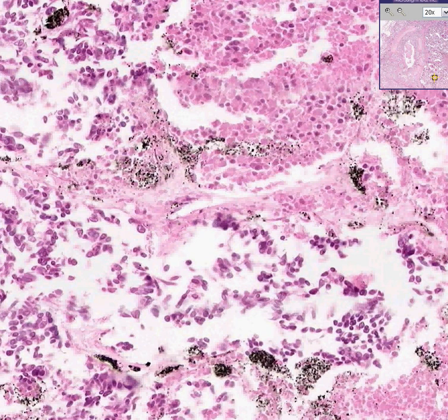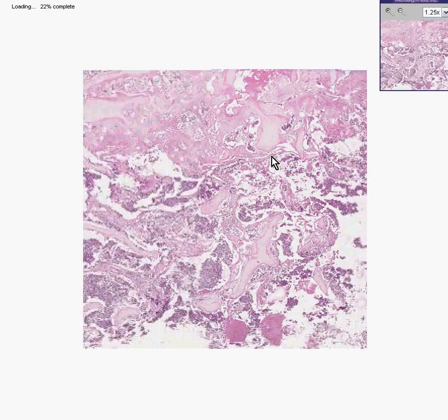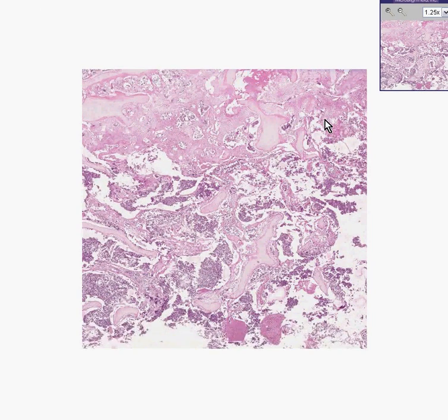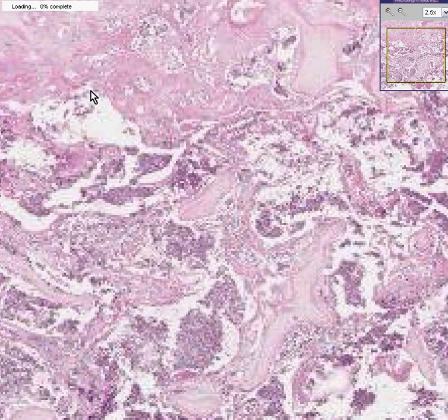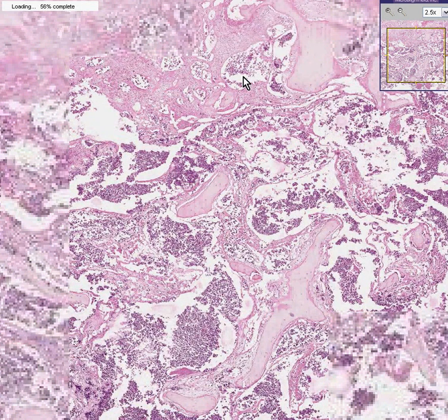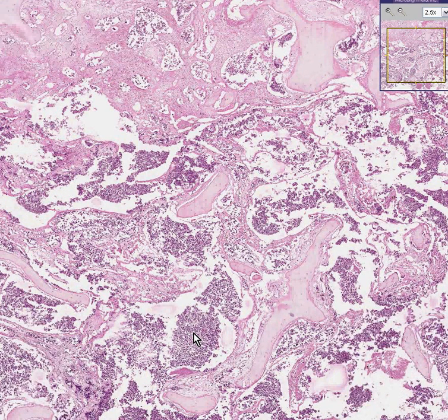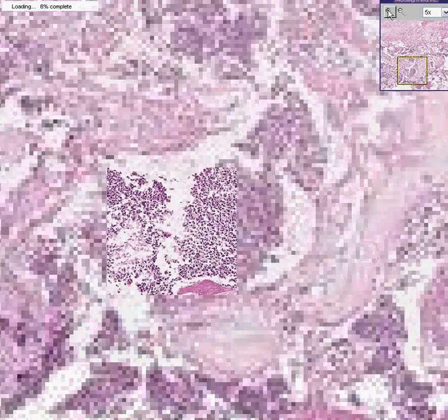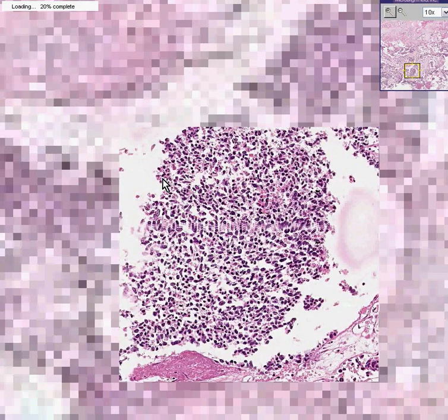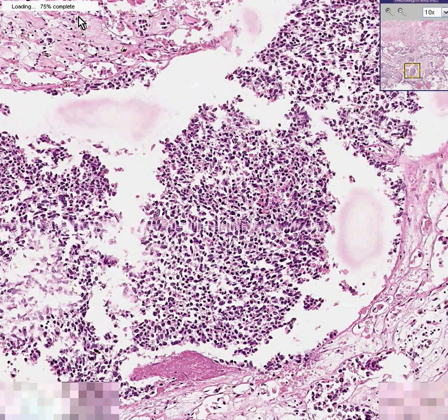Is there anything else we would like to see in this case? Let's go to another slide. Looks like we have some more lung out here. Even from this power, you could tell that basically the upper half or third of the field is necrotic — not much by way of delineation of cellular structures, although some are. And here at the bottom, it's not as necrotic. I'll center in on that area, blow it up, and prove to you once again that we have classical oat cells here. Perhaps a little more necrotic, but these are the classical appearance of small cells of small cell carcinoma, a.k.a. oat cells.